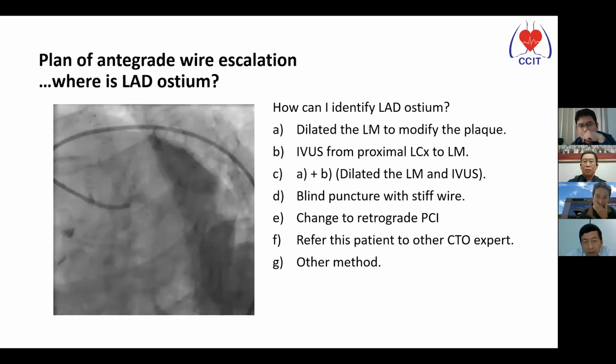That may be better than recanalizing from the ostium of the LAD and putting a very long stent in the LAD. That's another option. How about Dr. Annie?